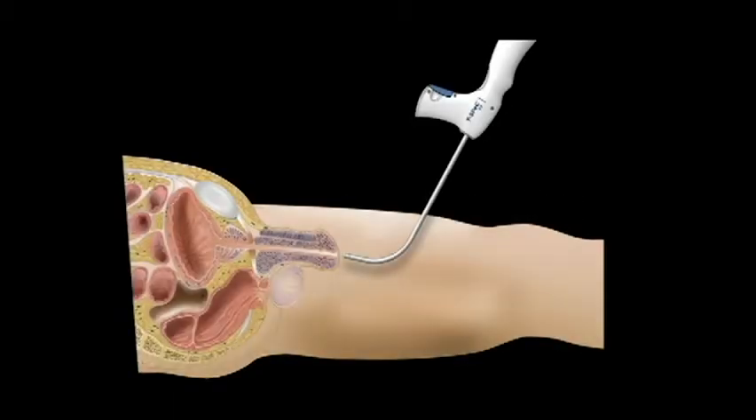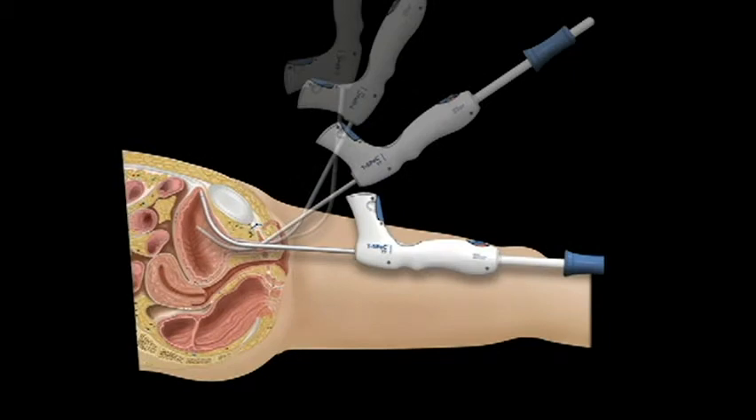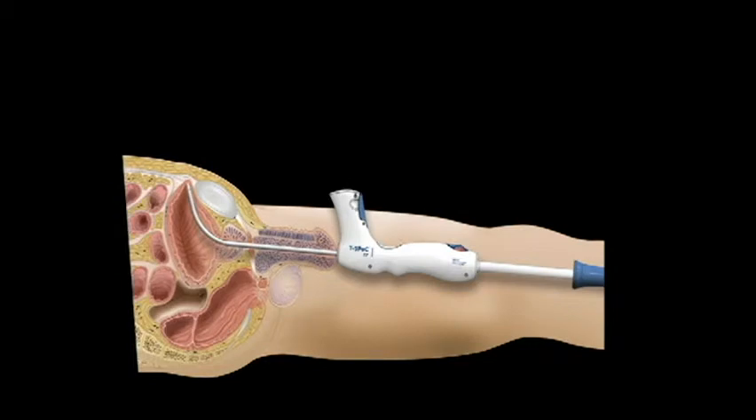Additional contraindications include patients with untreated urinary tract infection, patients with intestinal obstruction, and patients with femoral-to-femoral bypass grafting. Procedure steps are the same for male and female patients. The stainless steel T-Spec sound with embedded cutting blade is inserted into the urethra and bladder. The silicone bullnose tip of the sound facilitates smooth insertion for male or female patients. The pubic bone is easily detected adjacent to the sound tip and helps ensure optimal placement of the surgical tract.